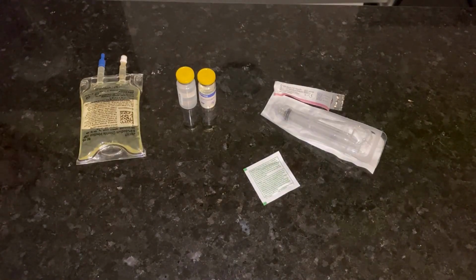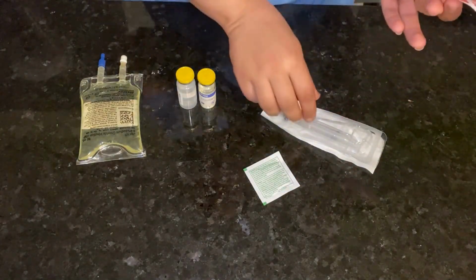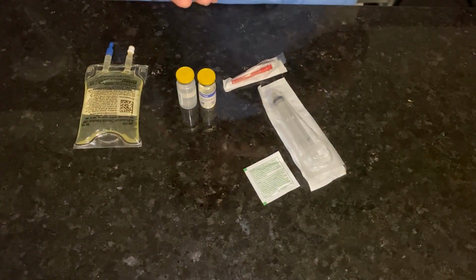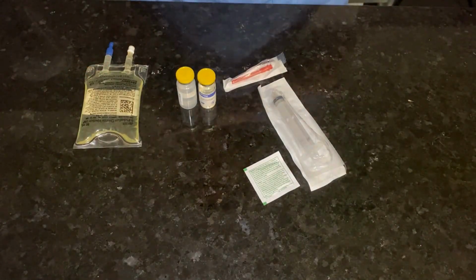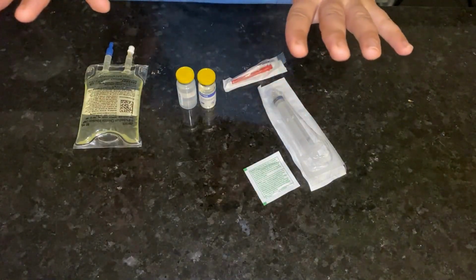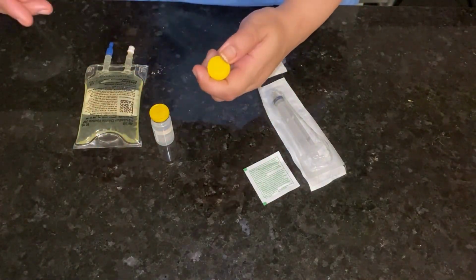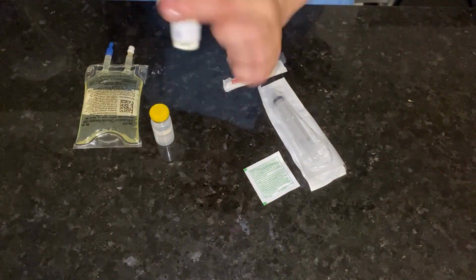Okay, this is the practical part of my assignment. First of all, I didn't have the sterile needle, the blunt needle, and the syringe, so we assume that they are all new, and also my mini bag. First of all, I'm going to sanitize my hands. We assume that this area is also clean because we should follow the aseptic technique. So I'm going to let it dry. Okay. Perfect. I need to open this lid. We assume that this one, the powder, is the pantoprazole IV.